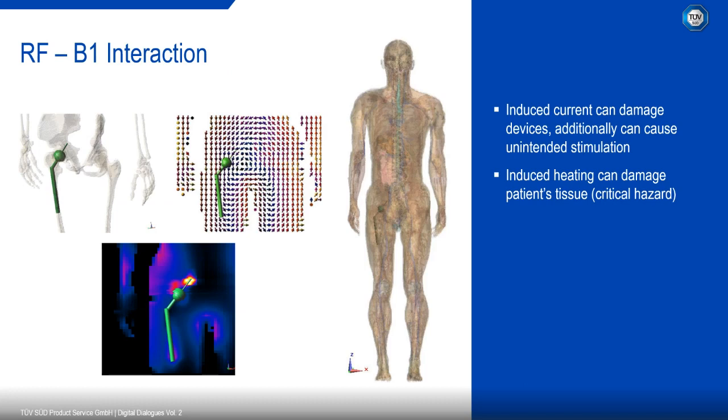Well, the result of the simulation shows the highest induced power at the tip of the screw for this specific test. This is the result, which can be verified by conducting metrological measurement in the real MRI scanner or an equivalent test system.